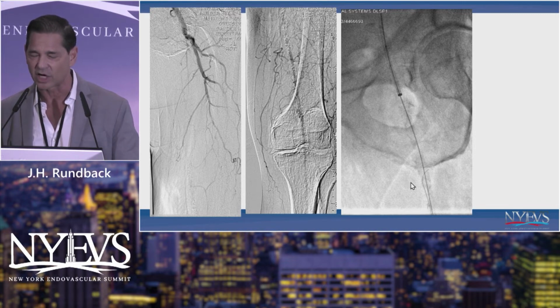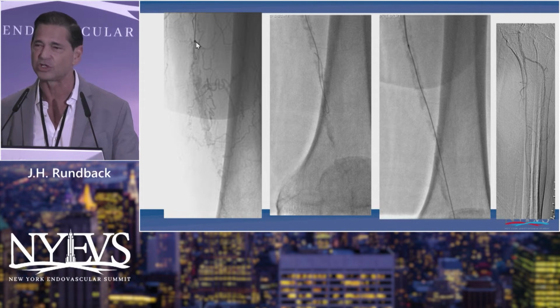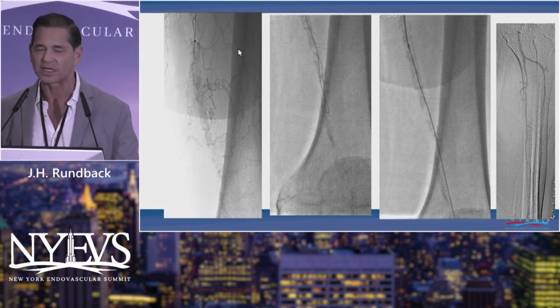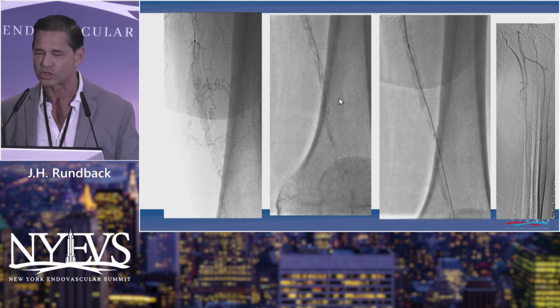Once you engage, now you knuckle that wire down, you come down sequentially. Here's actually the tip of the balloon, and as you know, you kind of advance, so you get that knuckle, and then you advance the catheter or the balloon. You shorten that knuckle so it's in the range of about 3 to 10 millimeters, and you sequentially sort of do this until you get down to the point of reconstitution where theoretically, down here, you now spontaneously pop back in.